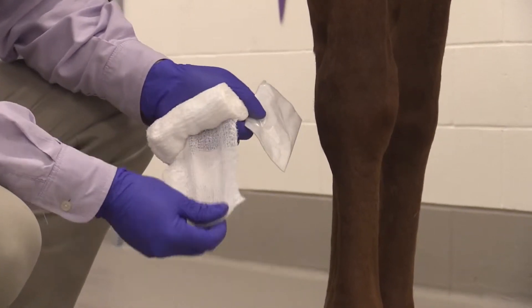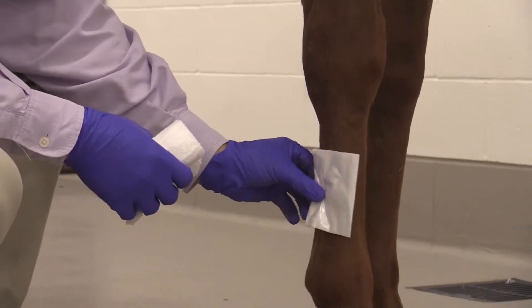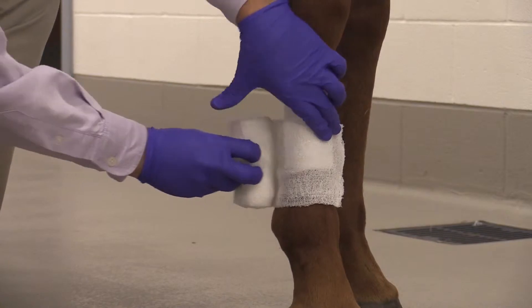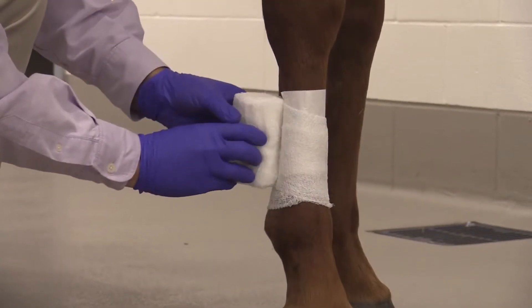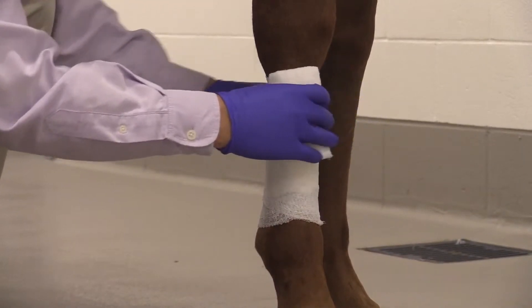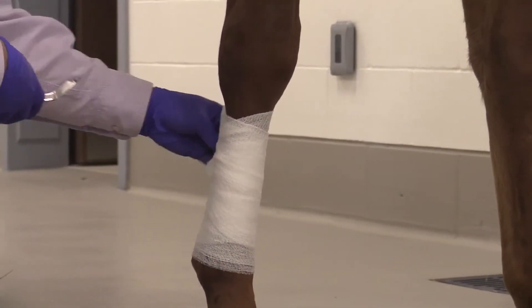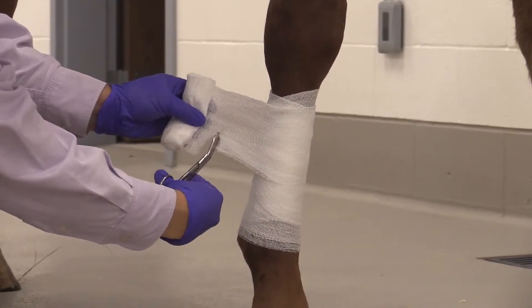That gauze has a stretch to it, so it forms around the leg and forms around the non-adhesive bandage material. Placing the bandage material on there, we'll usually start below or above and overlap by half as we work up the leg. It's not going on tight, but just snug so it holds that Telfa non-adhesive pad to the wound and it doesn't slip out either at the top or the bottom. We will then cut off the excess amount of material with bandage scissors.